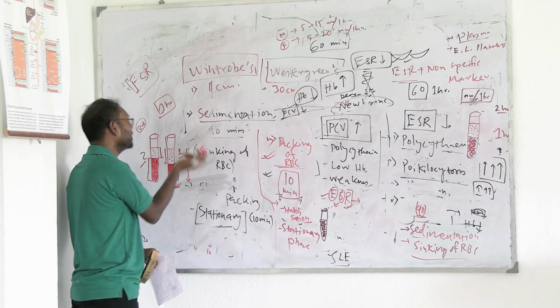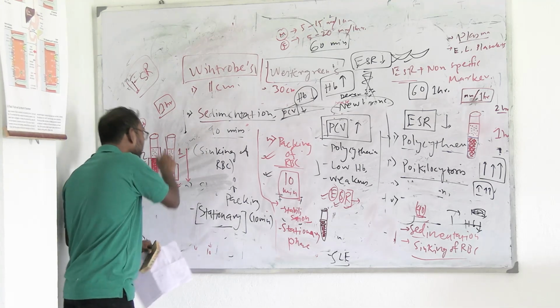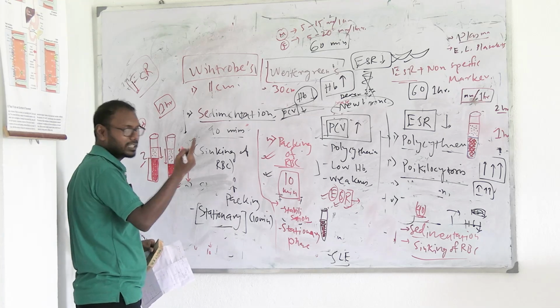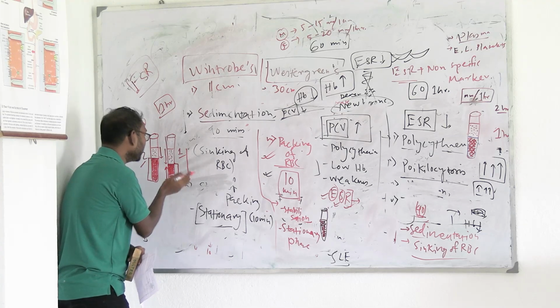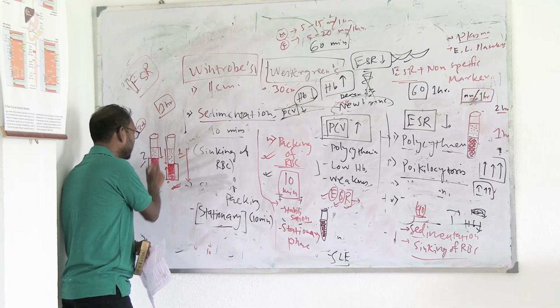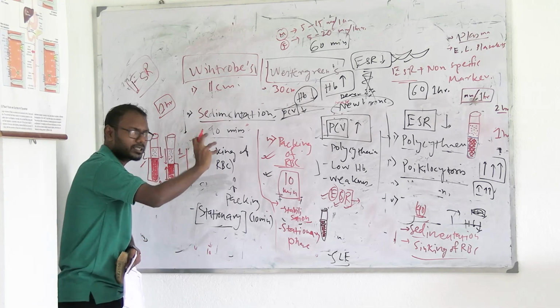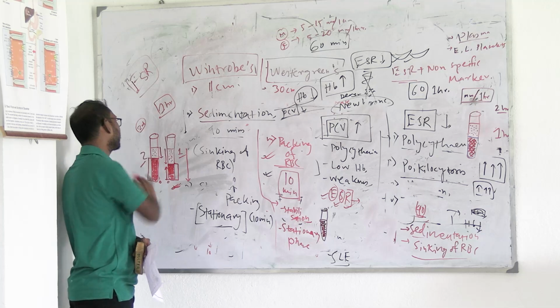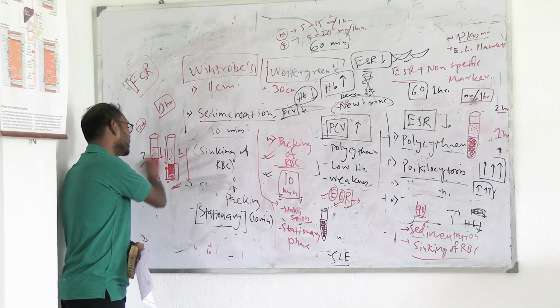So the sedimentation rate is definitely better in that person, and that's why in a similar tube we can measure PCV, but we will have to measure from below. Okay, here the 0 will be at the bottom, and in this person also we will be calculating packed cell volume from below, because the more the cells, the more the volume is. So the packed cell volume is better in this person, but his sedimentation rate is lower than this person.